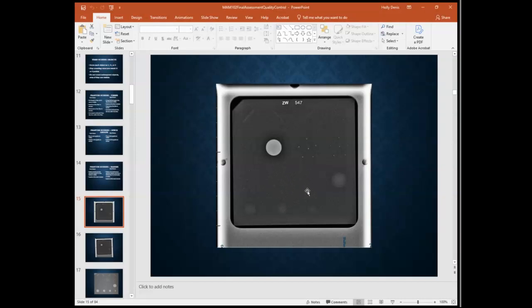Now moving on to this group that's supposed to be here, I don't see a thing. I don't see not one little speck, so there's no point for that. Now, if I could only see 3 here, 1, 2, 3, then this would only get half a point. But I can see 5, so I would score it another full point. So these fibers would get 1, 2, 3, 4 points from me.